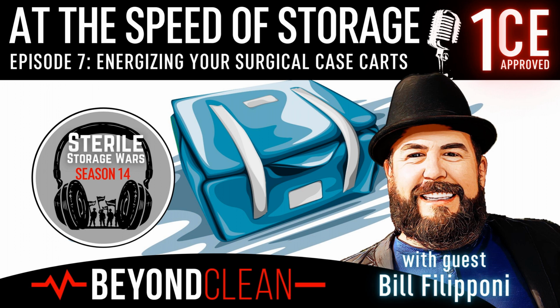And when we were buying new ones, we went to our maintenance department and said, hey, look, this is what the new one is. These are the parts. What do you guys think? Do you think this is a good idea? Do you feel like you can replace these if something would happen? We kind of got buy-in from both sides when we were looking at new case carts.